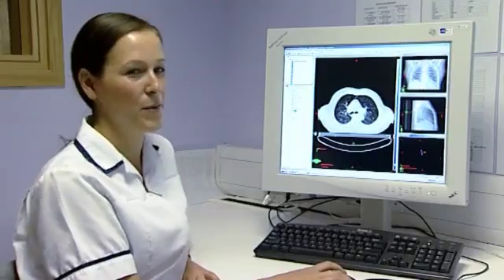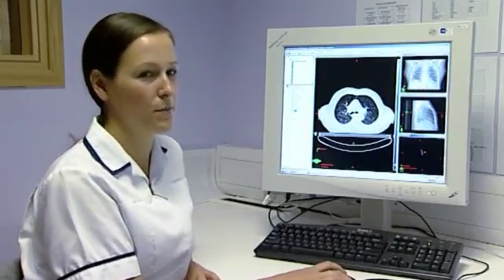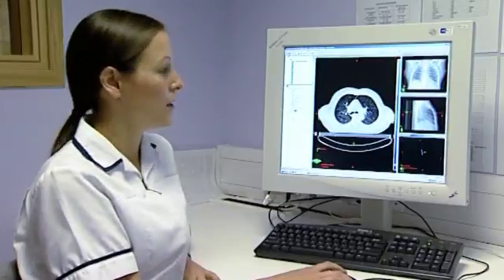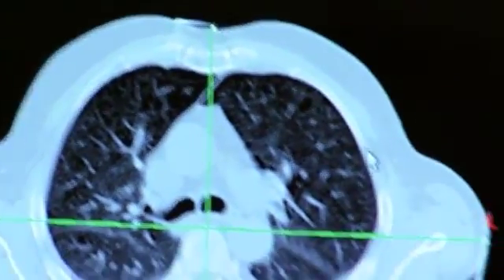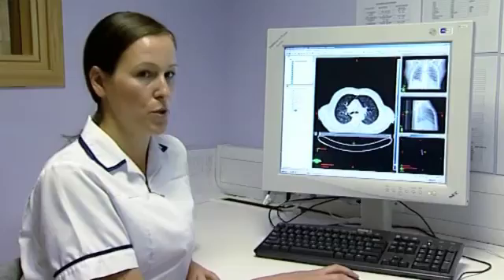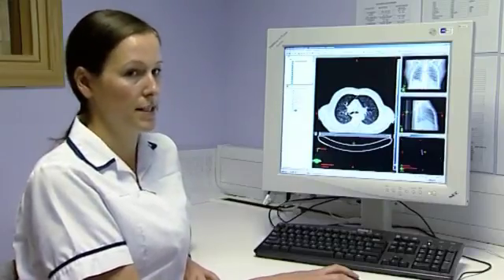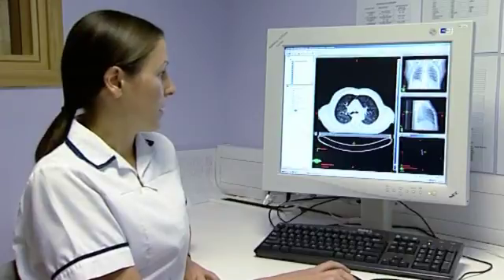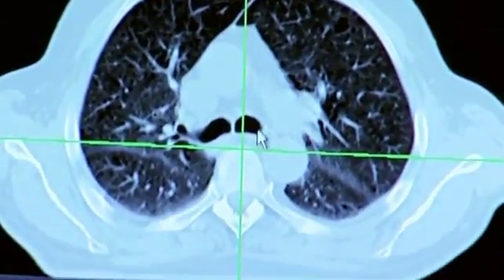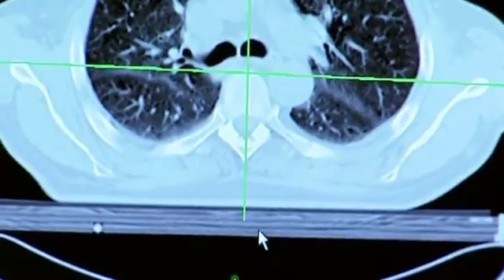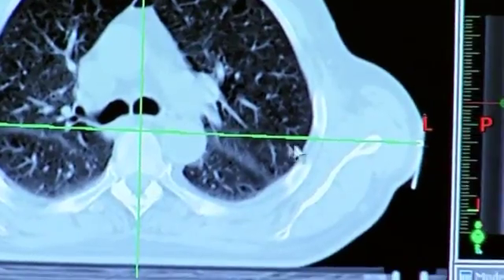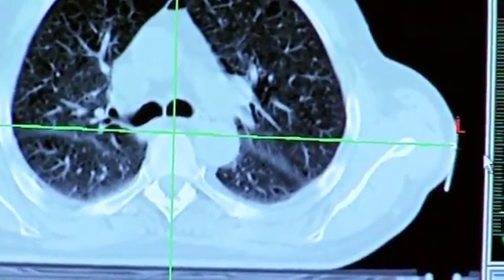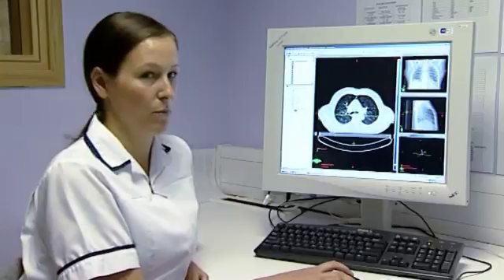The final task we need to do in contouring is to define the position of the tattoos. These are defined by the position of these three markers that the radiographers attached fiducial markers to at the time of CT scanning. We apply a vertical line through the anterior tattoo and a line between the other tattoos so we can determine the position of those at the time of CT scanning and relate that to treatment. From here on, we now go into treatment planning.